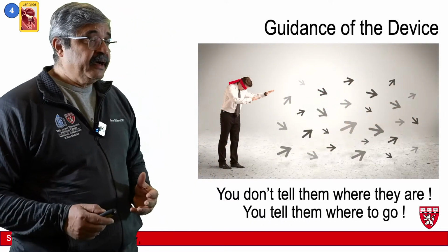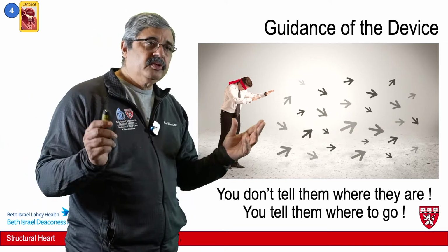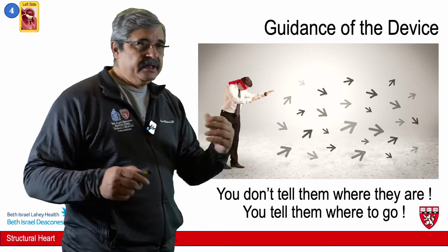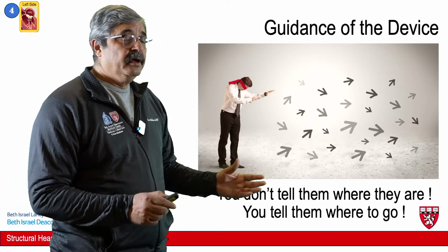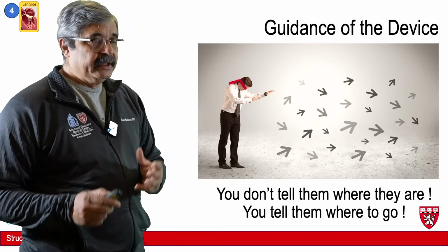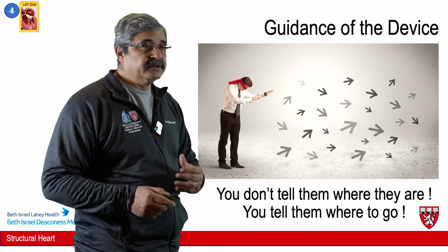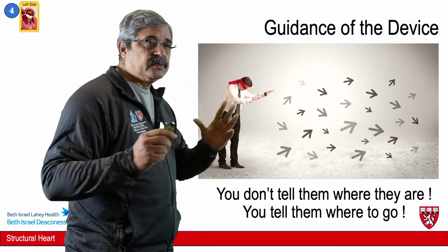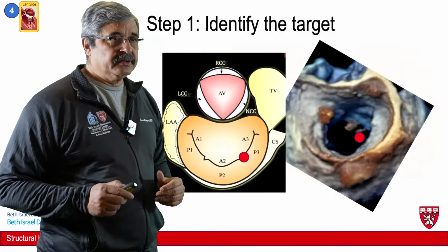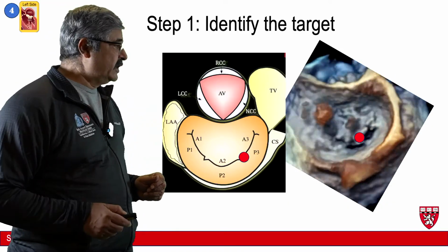Now, for the guidance of the device, the major principle is like guiding a blindfolded person in a room to a certain specific target. When they're blindfolded, it is of no value to tell them where they are. More important is where they want to go. That is more valuable information. You want to go left, right, front, backwards. Just telling them you are at this location, to a person who cannot appreciate the X, Y, and Z axis, is no information. For example, step one in this situation would be to identify the target.